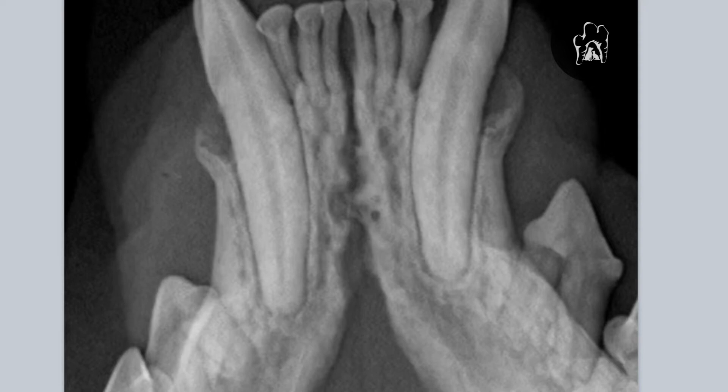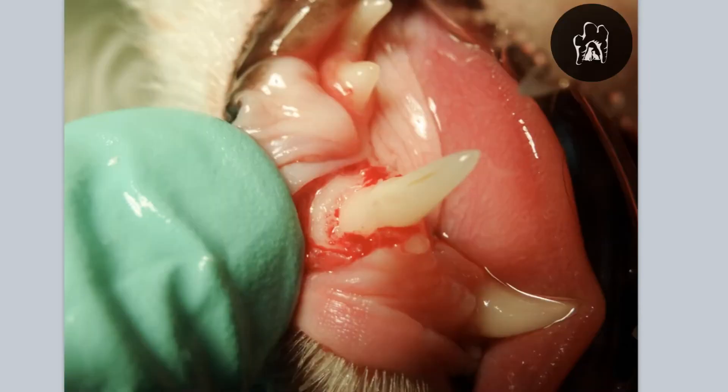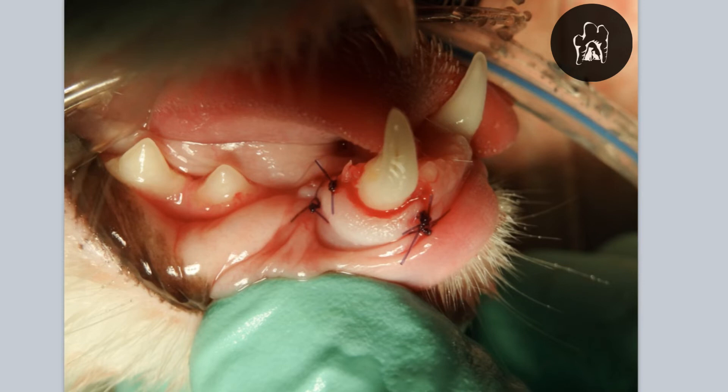Looking at it grossly intraoperatively, you can see there's a lot of debris on that root — either necrotic cementum, calculus, or both. So we do root planing to remove that, then we contour the bone and eliminate that granulation tissue between the bone and the tooth root. Now we've got a smooth bone transition to suture the gingiva back to at a level that's more apical.